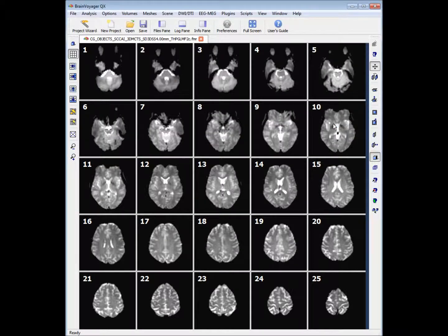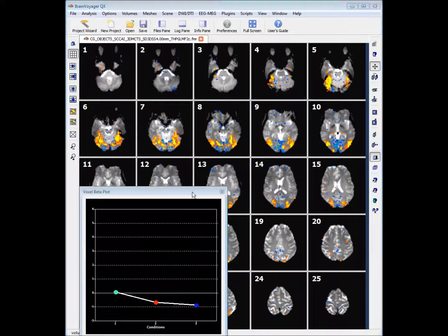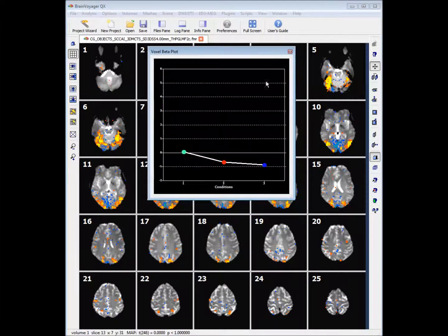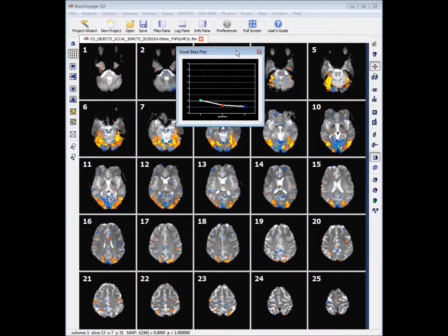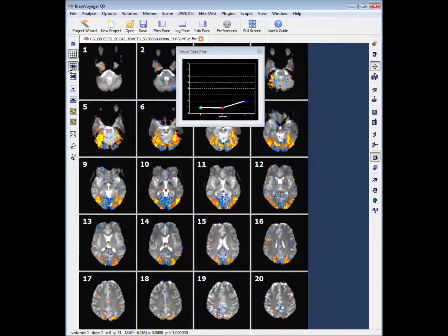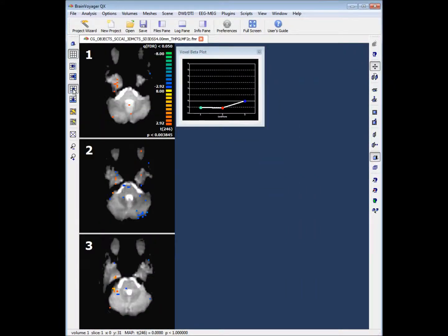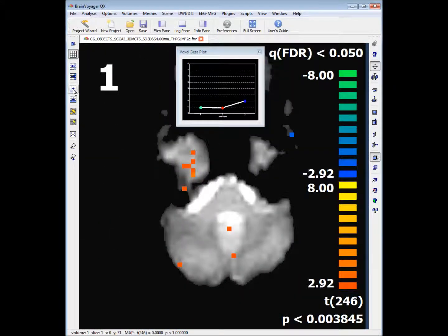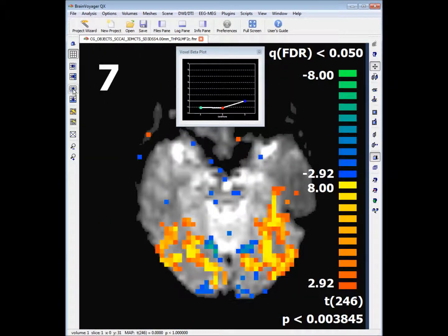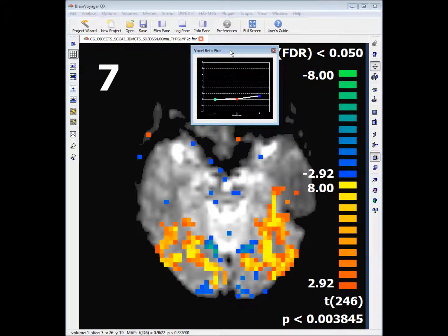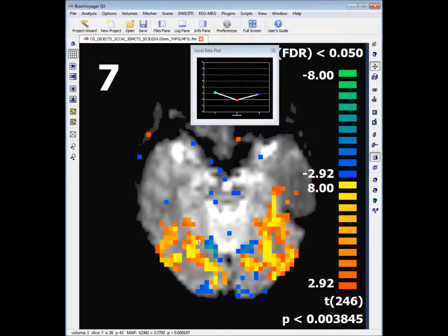What we have overlaid on our slices are voxels that have exceeded some statistical threshold. If we reduce our slices down to slice 7 we can see that there's a lot of pixels that have been highlighted. We also have this voxel beta plot. What this shows are our beta values for each voxel or each region of interest, so we can see to what extent each predictor has a more significant effect.